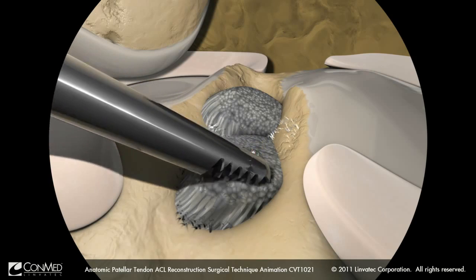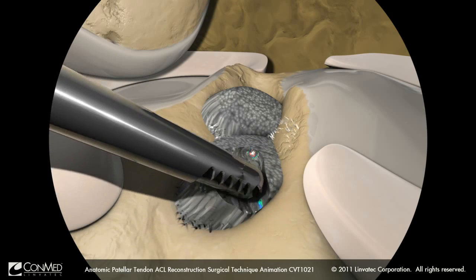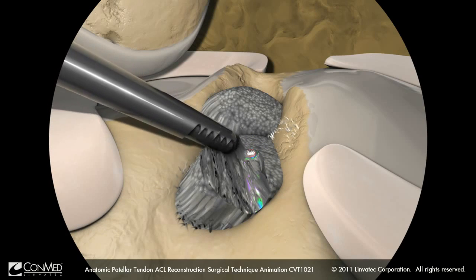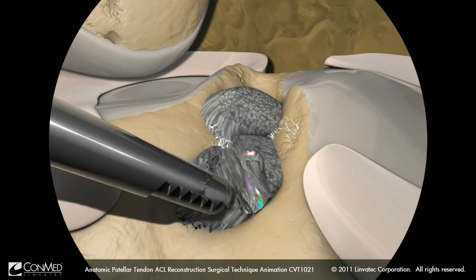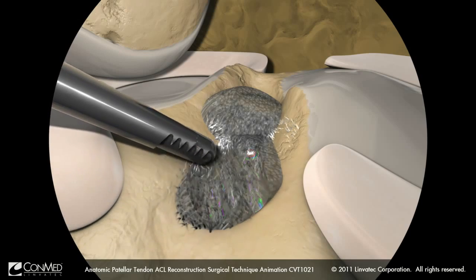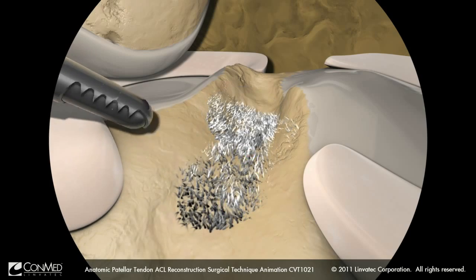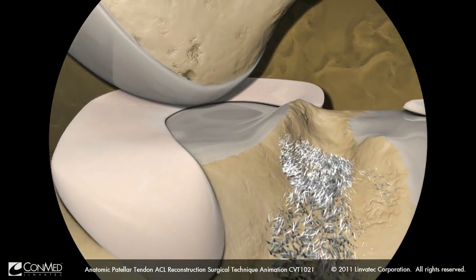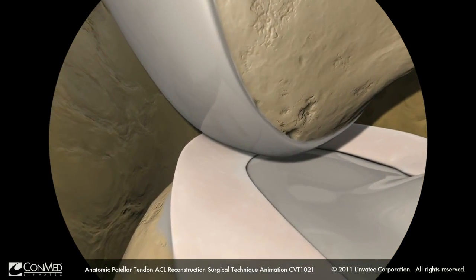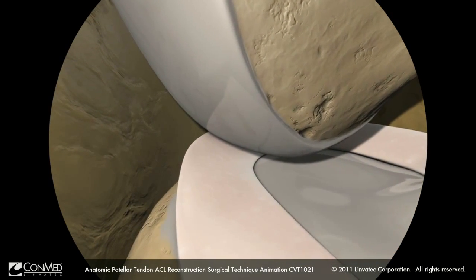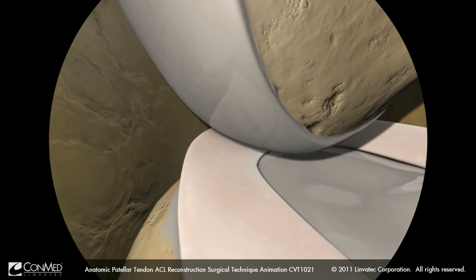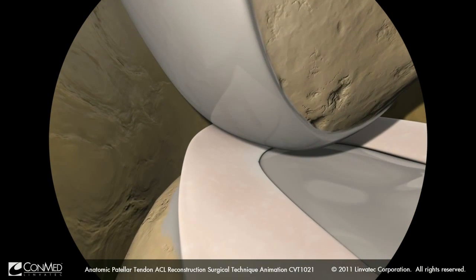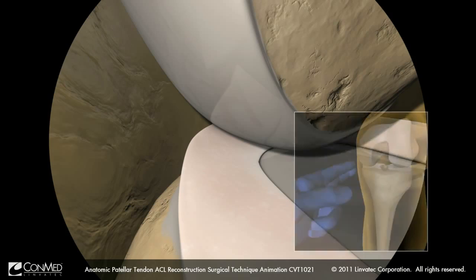Insert a ConMed Linvitec shaver to excise any remaining ACL tissue. Creation of the accessory anteromedial portal is made under direct visualization with the arthroscope placed in the anterolateral portal looking medially.